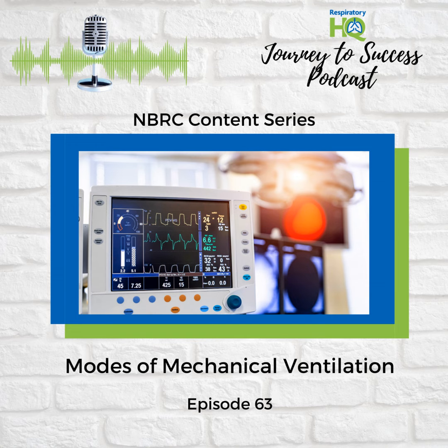But like you said before, there's a delicate balance to strike. Weaning too quickly can lead to fatigue and ultimately set the patient back. So it's not just about choosing the right mode, it's about making careful adjustments along the way. What are some of the things clinicians are looking for when they're making those decisions?